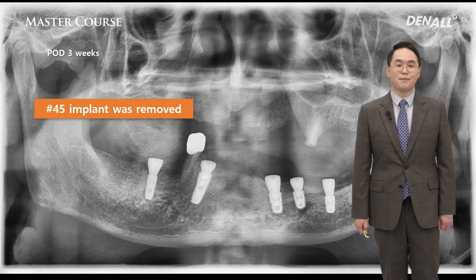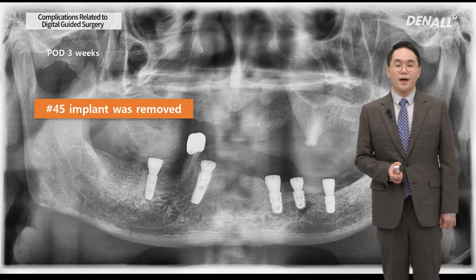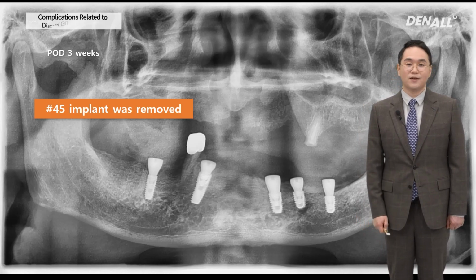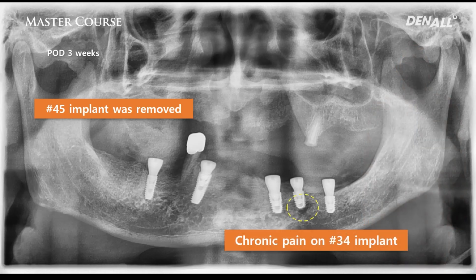In other words, a bridge. And the patient came to me and said that the right side was now better, but on the left side, the patient was now experiencing throbbing pain in the lower. I took a look at the panoramic image, and around number 34, there is an apical lesion. You can see the radiolucent lesion.